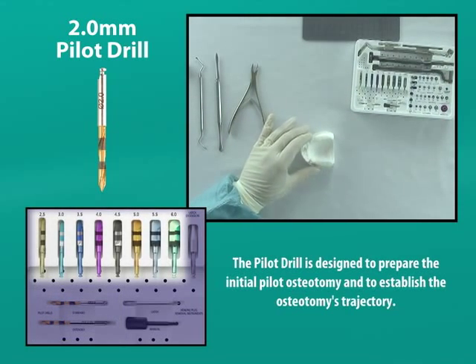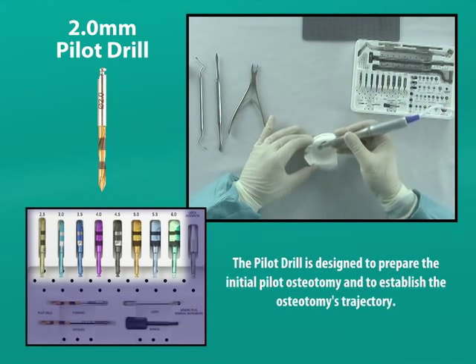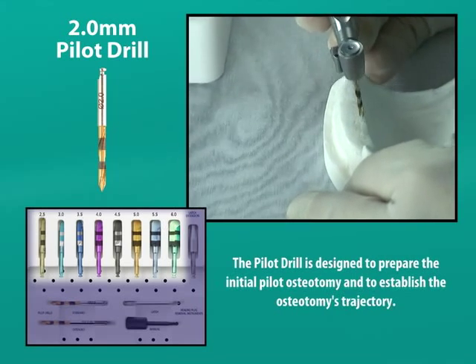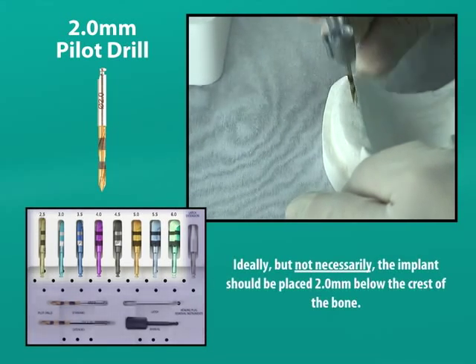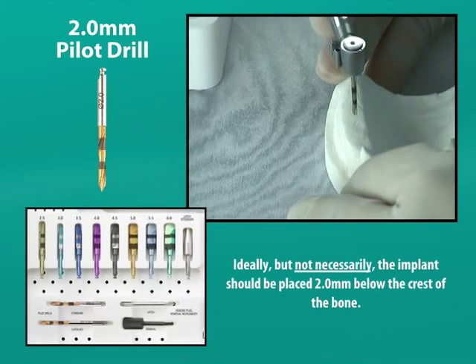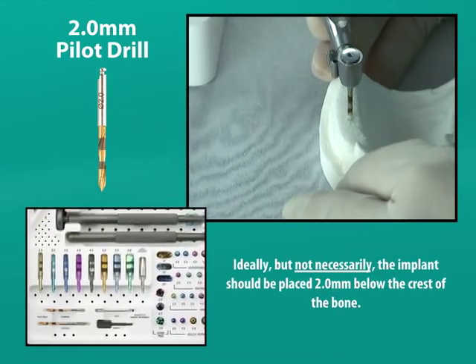The use of subsequent latch or hand reamers with 0.5 millimeter incrementally wider diameters will only widen the initial osteotomy. Ideally, but not necessarily, a Bicon implant should be placed two millimeters below the crest of the bone to optimize its clinical capabilities.